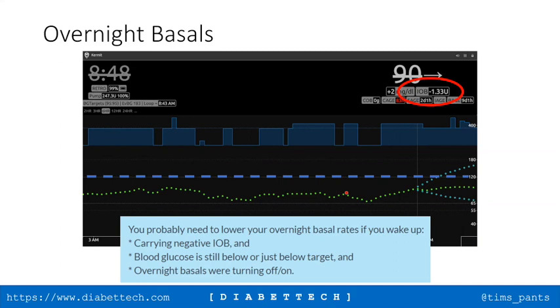I agree with him. You should definitely use more days before you change something. But I would put here my experience when you have a child, especially small child, then the sensitivity and everything is changing really fast. And in our case, a situation like this indicates that the insulin amount we need is much lower. And if this happens during night, it will continue during the day as well. So in this situation, when you have a child, I would definitely start some lower profile, like 80%, 90%, something like this.